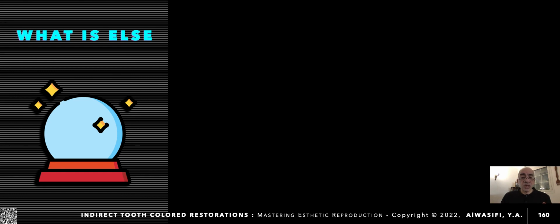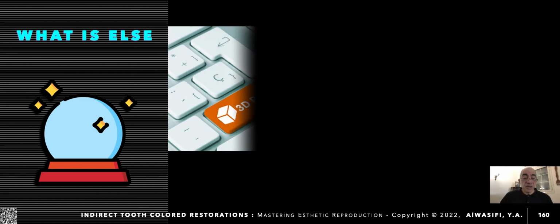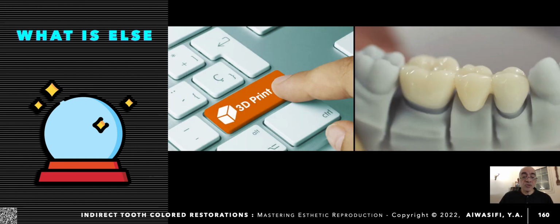But surely there will be another shift to additive construction rather than subtractive one, by 3D printing, which is expected to be introduced into the digital dental market as soon as possible, as 3D printing is already introduced into the field of human body prostheses, including arms, limbs, and other prostheses.